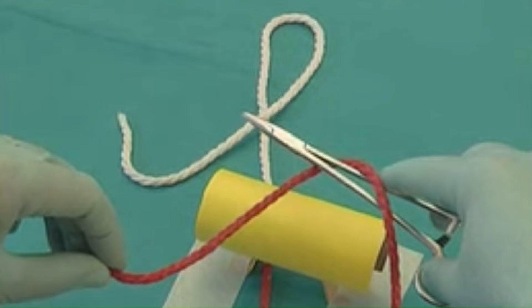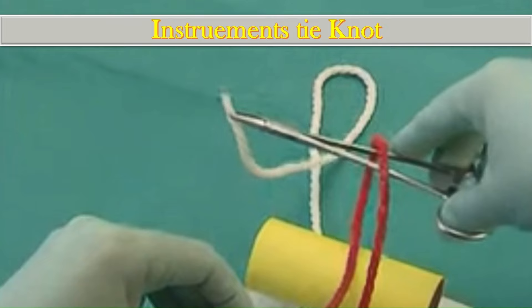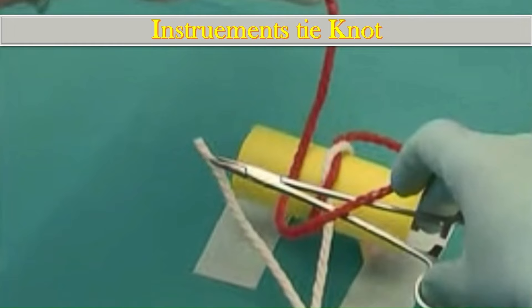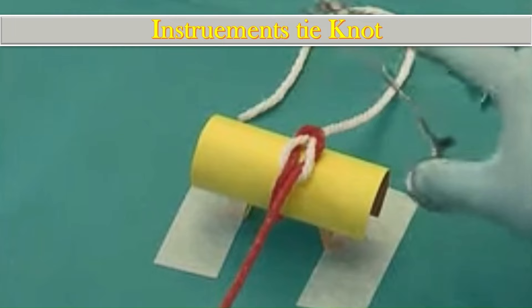Next comes the instrument tied knot. Take the needle holder and make a loop of the pink thread around the needle holder, then grasp the white end with the needle holder and bring the thread towards you. Now open the needle holder and hold the other end of the thread in the same way to form the knot, which is then tied.